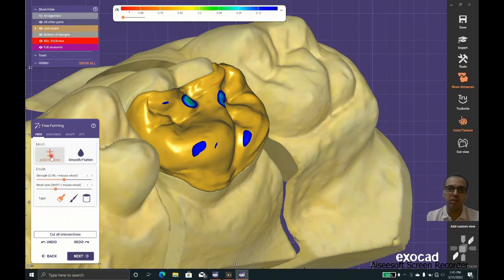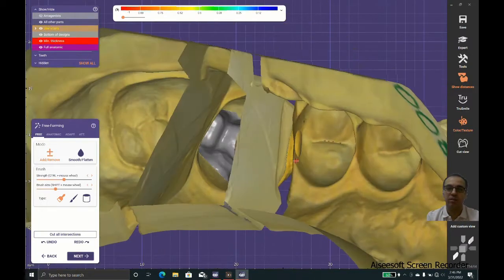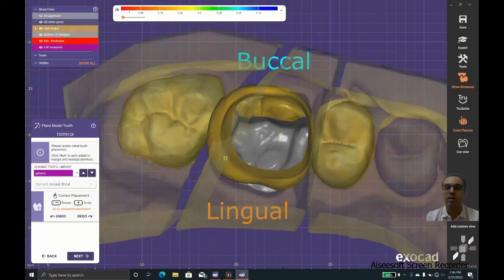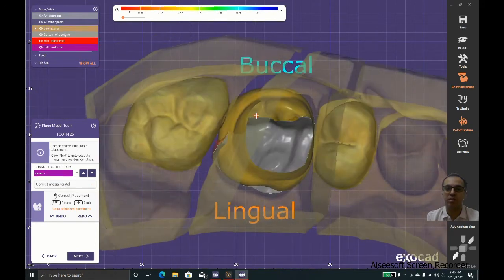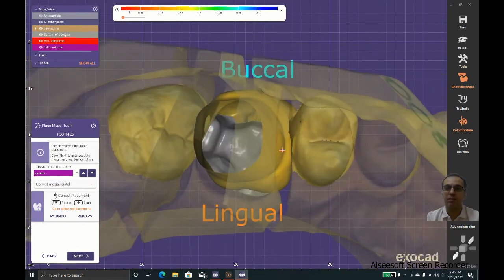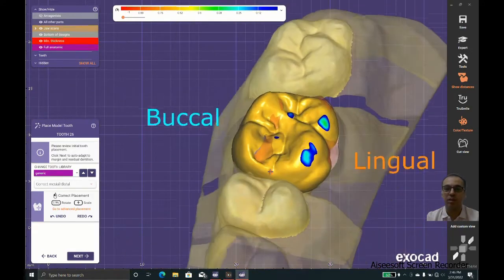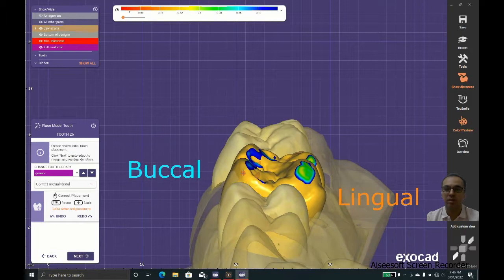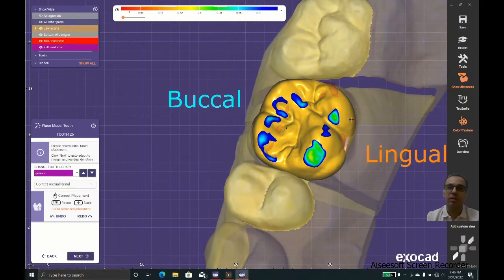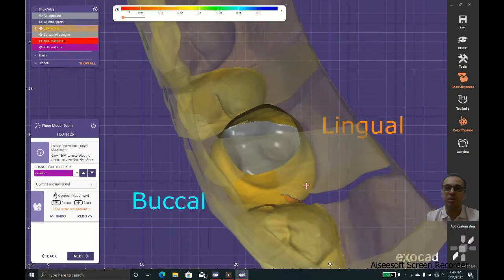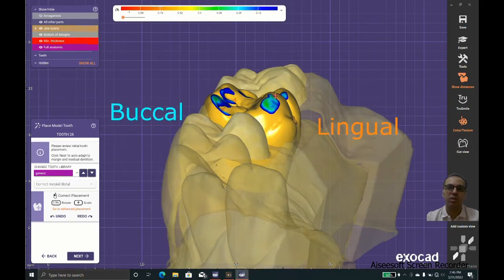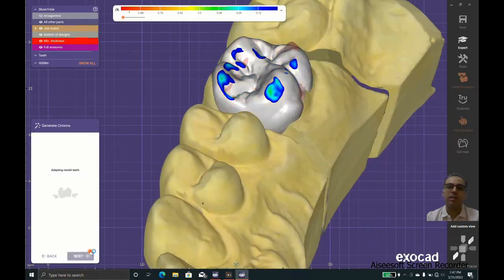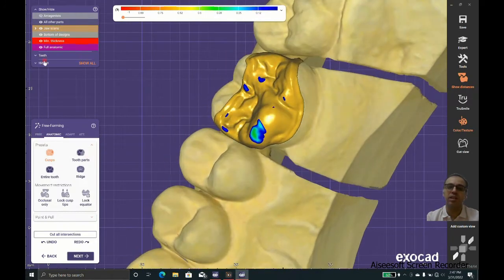In this case, look what we have here. We have a disaster because we scaled in the mesiodistal direction too much. We have the marginal ridges going farther than the place that they should. The software could give you some results, but in case that you scale too much or do too much free form, the anatomy of the resulting piece is not satisfactory.